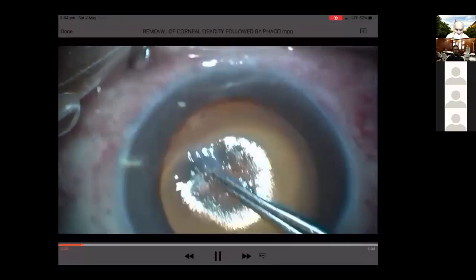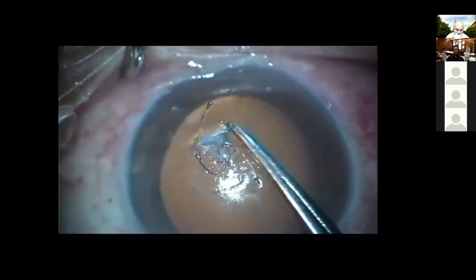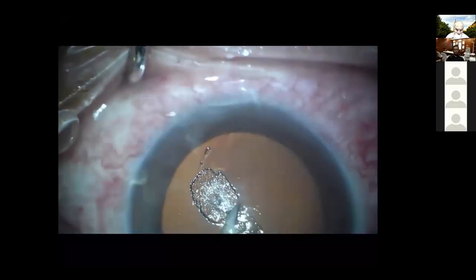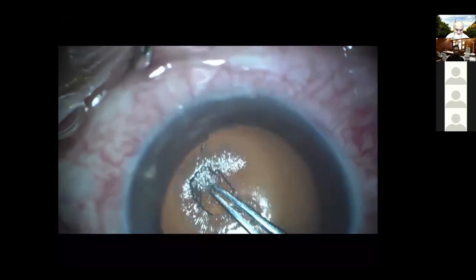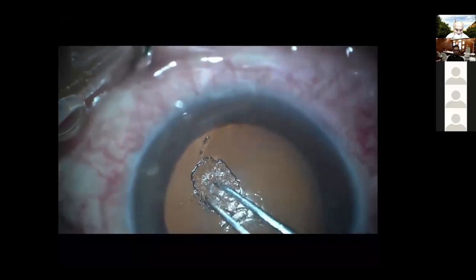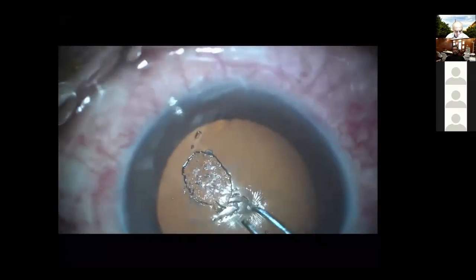Okay, I am showing the video now. This is a case of Salzmann nodular degeneration combined with a cataract patient. I sometimes resort to removing the opacity manually, and there is always a plane of cleavage between the nodular granulomatous tissue and the rest of the cornea. This would provide, after removal, both the surgeon and the patient quite a satisfactory vision, so you do not have to resort to penetrating keratoplasty in such cases, as you can remove almost all of the opacity without doing much harm and much damage to the cornea.